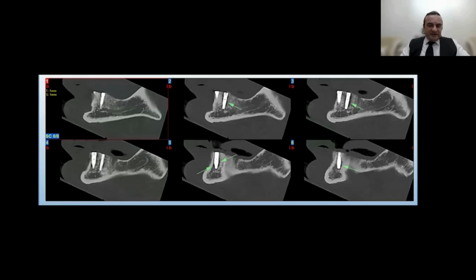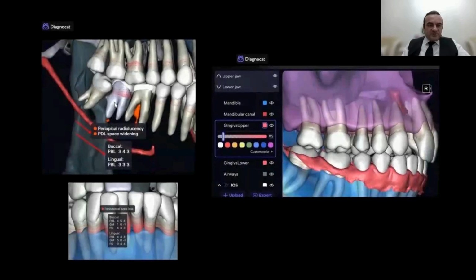Then it's going to be also a game changer for CBCT, because one of the most problematic parts is detecting peri-implantitis. We can very easily overlook peri-implantitis cases because of artifacts like the exomass effect. But now the AI can make the segmentation and provide decision support on what is peri-implantitis and what is not.